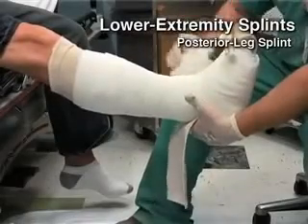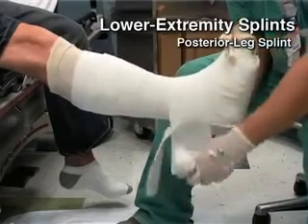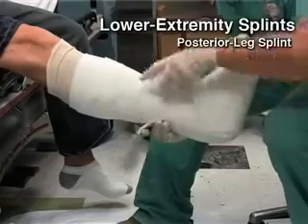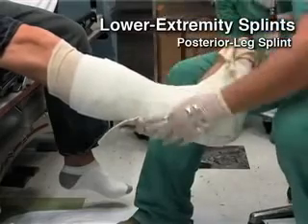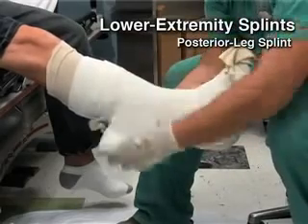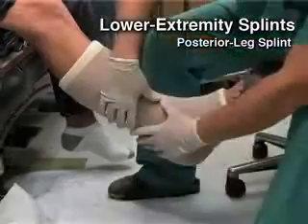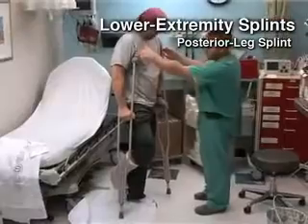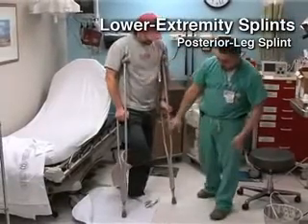A posterior leg splint is used to stabilize severe sprains, reduced ankle dislocations, and fractures of the distal leg, ankle, and foot. The splint extends from the metatarsal heads to just below the fibular head while maintaining a 90-degree angle at the ankle. Be sure to keep the fibular head free to avoid compression of the adjacent peroneal nerve. Lower extremity splints are not designed for weight-bearing, and the patient should use crutches to walk safely.